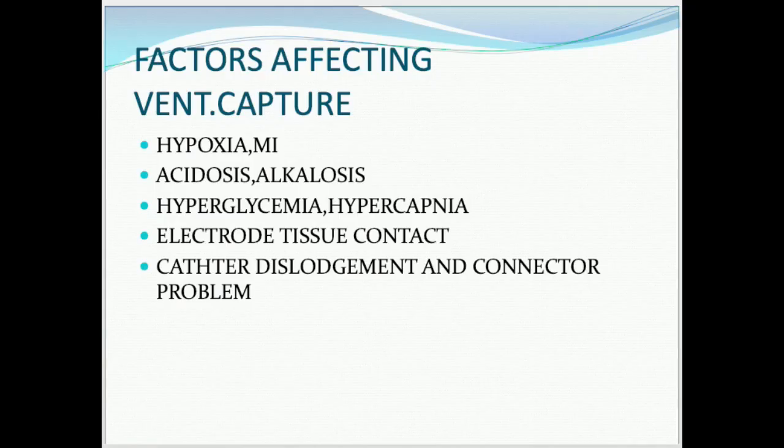During MI, when there is a loss of capture, first document adequate catheter position by chest radiograph, then electrograms, which can be corrected by increasing pacing output and possibly lead repositioning. In case of poor catheter contact, repositioning the catheter under proper guidance is recommended. Connector problems are acutely managed by increasing pacing output, followed by emergency replacement or repositioning of the lead.